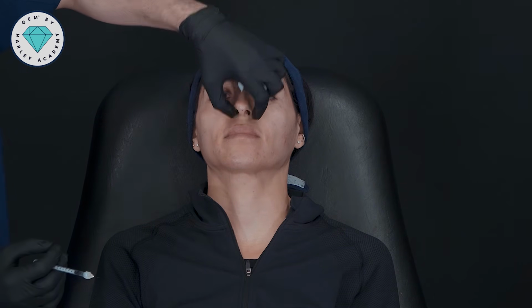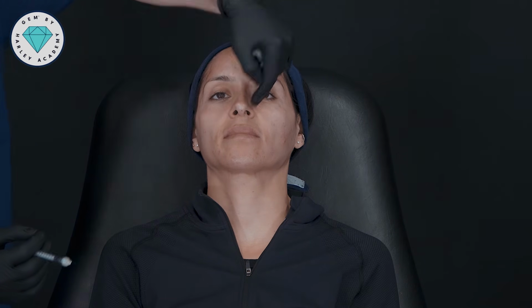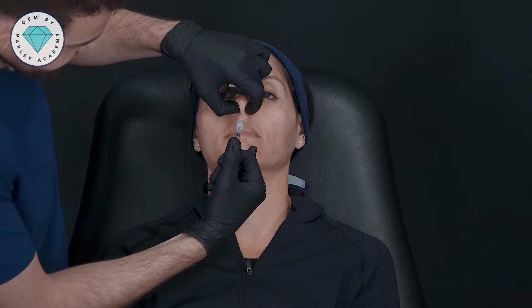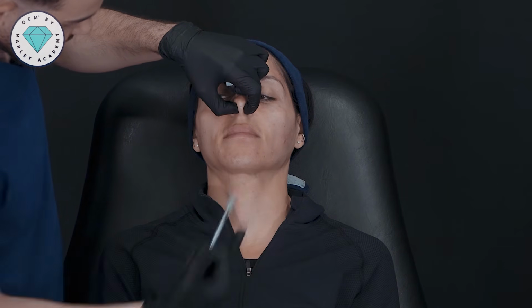Okay, so now this is the toxin injection I'm going to do before looking at the full face. So the first thing we want to do is reduce the depressor septi nasi muscle, which is creating this dipping of the tip of the nose. I'm also going to inject the wing or the alar of the nose, which will reduce the flaring as well. So let's start off with just 2 units down into the nasal septum. That's to treat the depressor septi nasi.